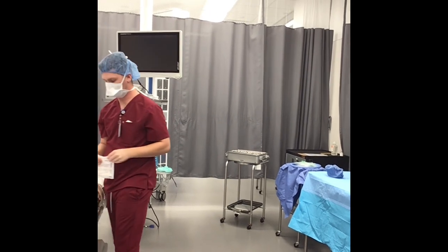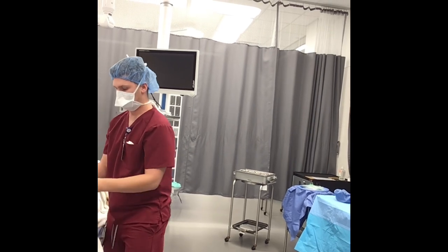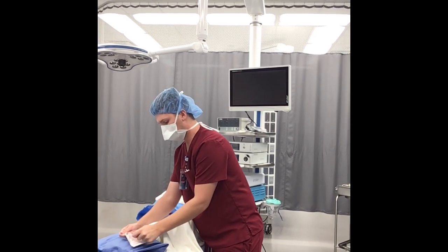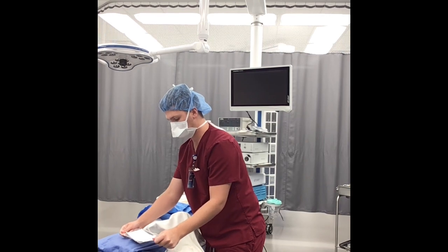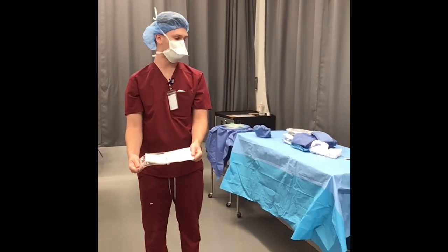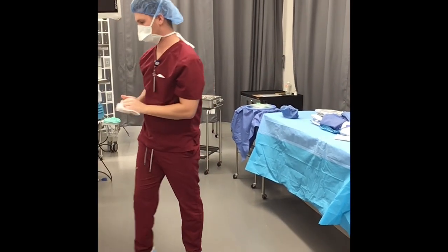Okay, next I'm going to do my gloves. So this is my outer glove, so this one's going to go on my back table. I'm going to open this up, controlling my edges, making sure my gloves don't go over the heat seal edge, otherwise I'll contaminate. And then this outer glove, the white glove, is going to go on my back table corner, closest to my gown. Same concept here.